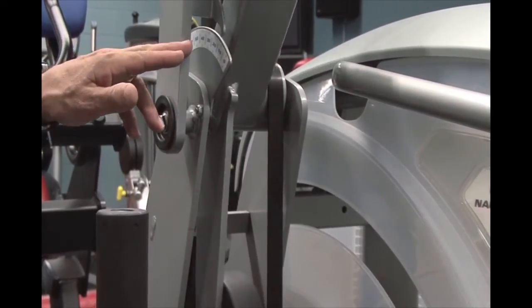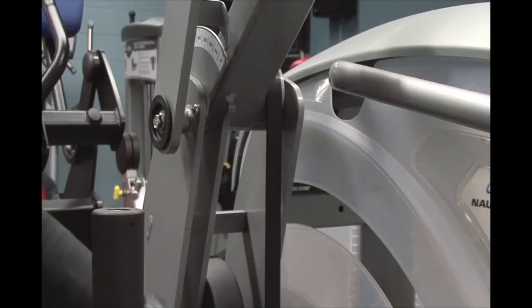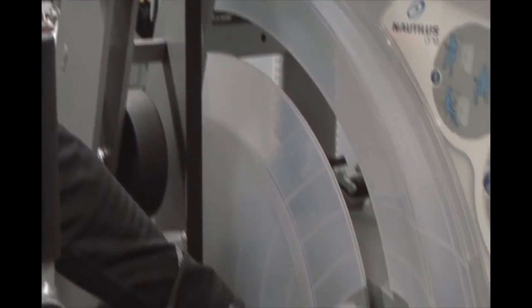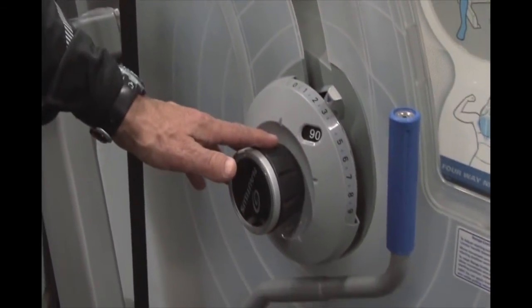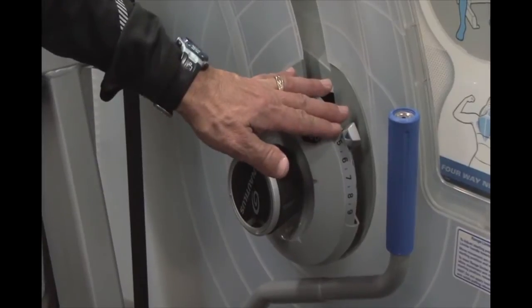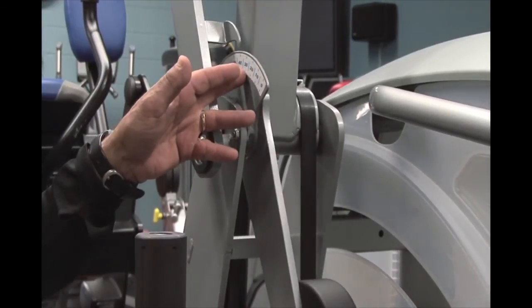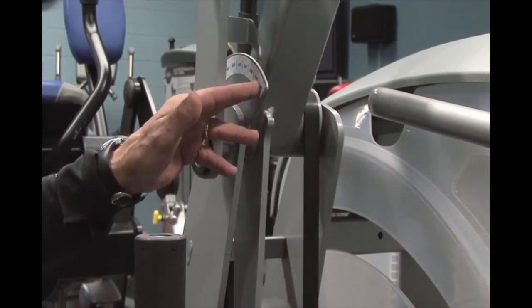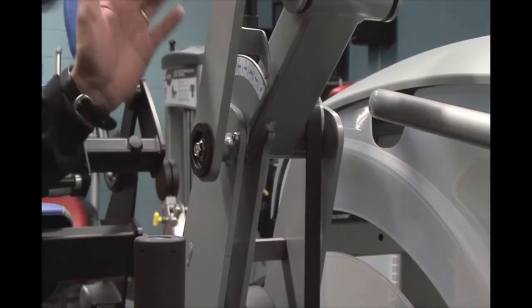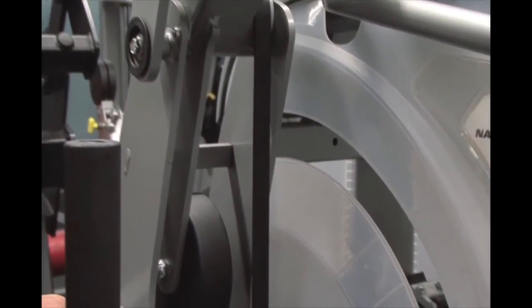So not only can we assess a patient's ability to move isotonic weights in a concentric and eccentric fashion and dose those weights in 1-pound increments, but we're also able to look at the patient's performance from a goniometric range perspective as opposed to an arbitrary 1-10 or other method of looking at range.